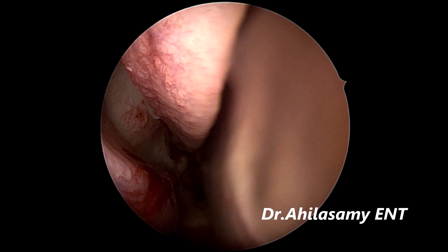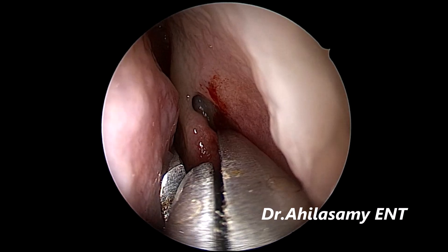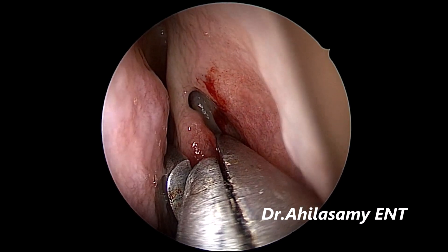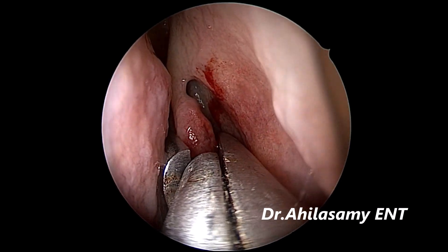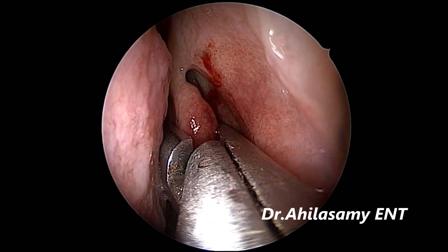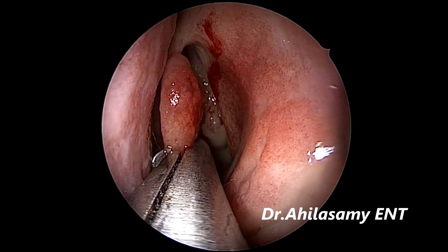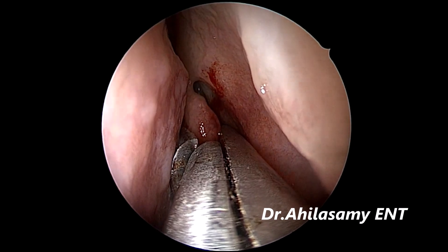With a solution of 0.5% lignocaine and 0.5% ropivacaine with adrenaline. Now I am giving the sphenopalatine block on the left side. Now I am going for the concha crushing on the left side with Dr. Ahila's concha crusher, which is available with Sando Surgical of Mumbai. Please buy the smaller size which is very useful.